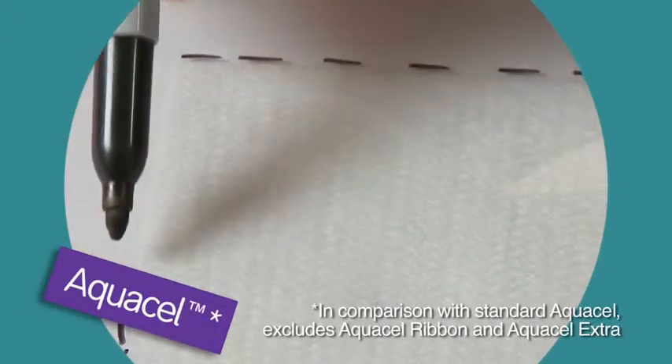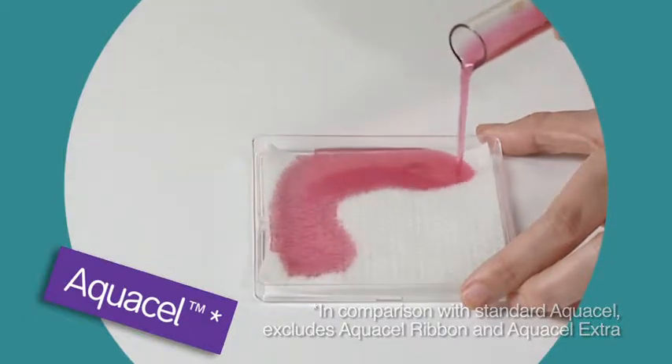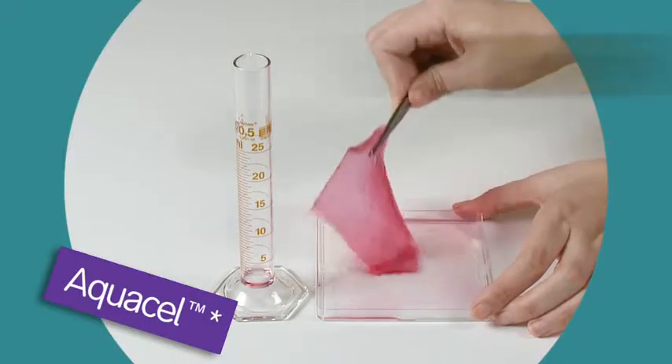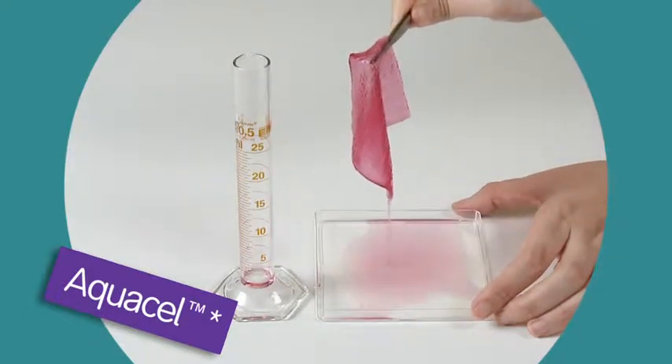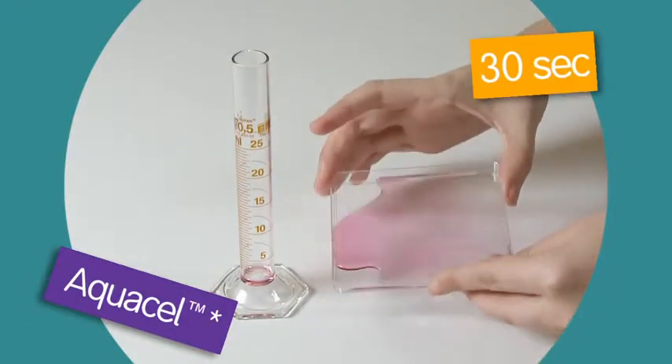Now we'll repeat the test, this time using a standard Aquacel dressing. Again 25 millilitres of fluid is added evenly across the surface of the dressing. We'll leave the dressing for one minute to absorb the liquid and allow 30 seconds for drip drying.